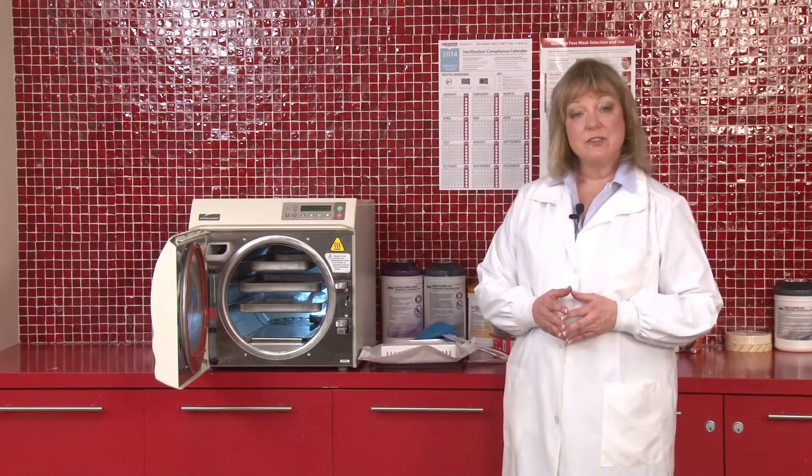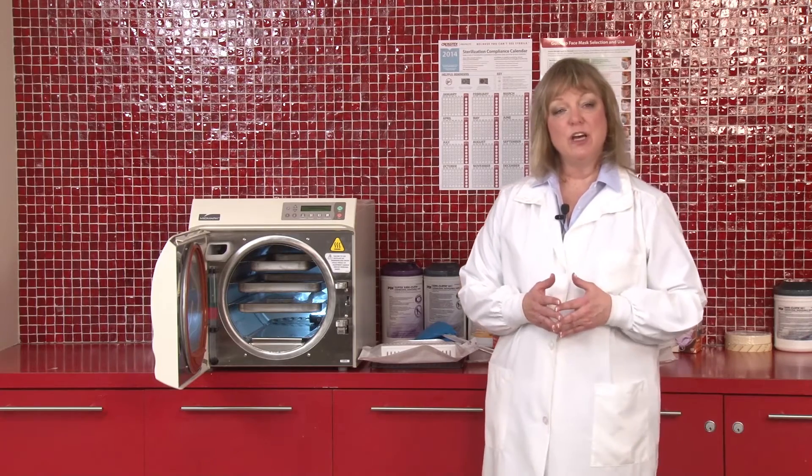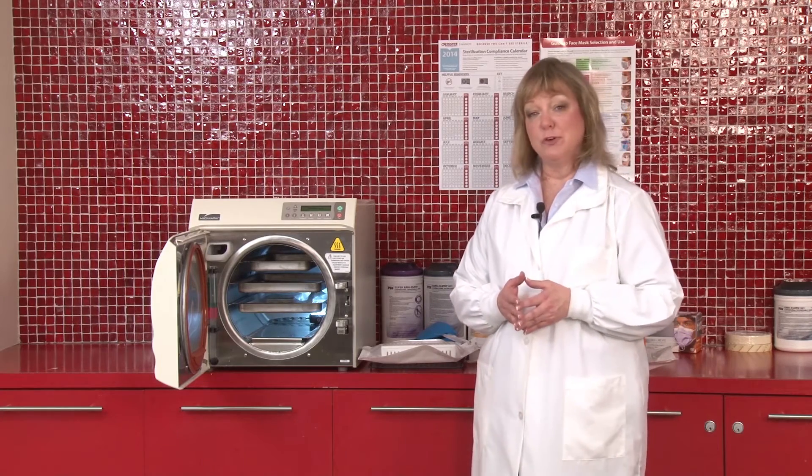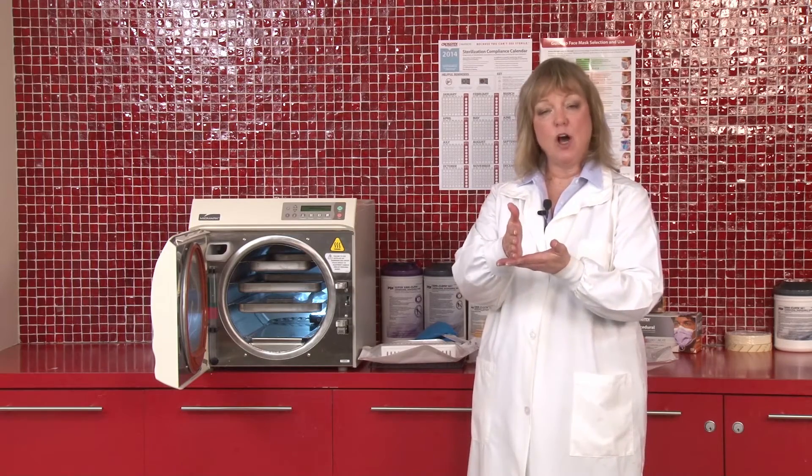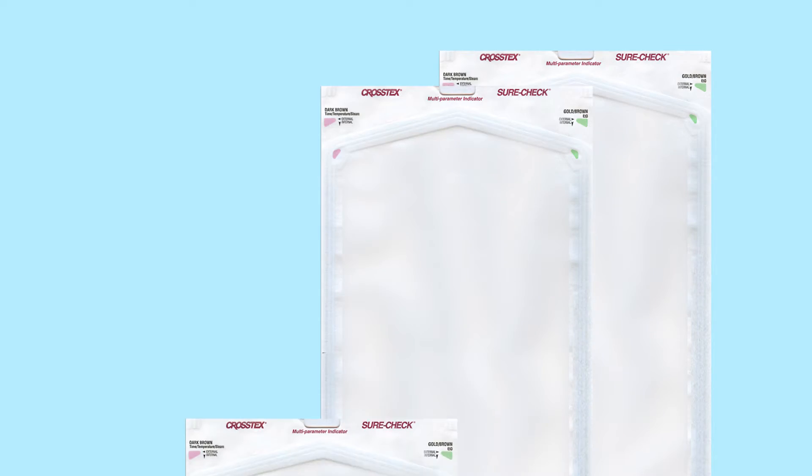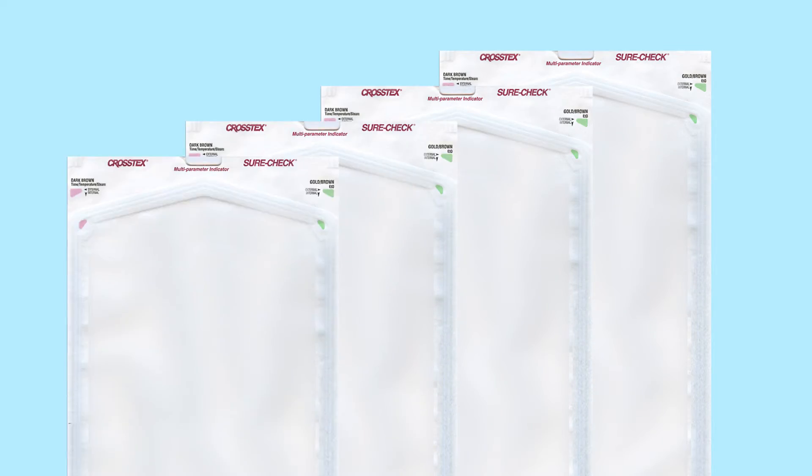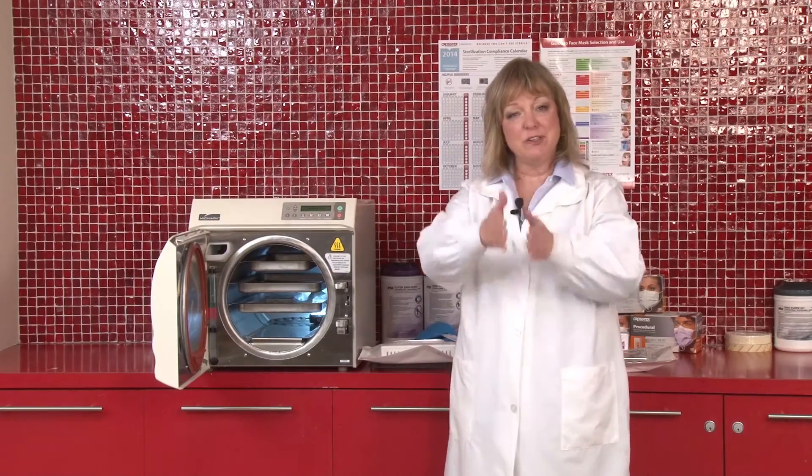If you are using racks inside your sterilizer, this is going to help you so that you can actually do what's a preferred vertical loading. If you place the pouches on edge, almost like books on a shelf, plastic front to the paper back, that's going to allow the steam to penetrate 360 degrees around the pack, again to ensure sterilization.